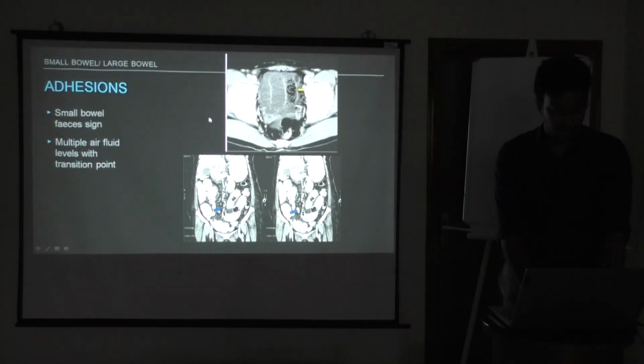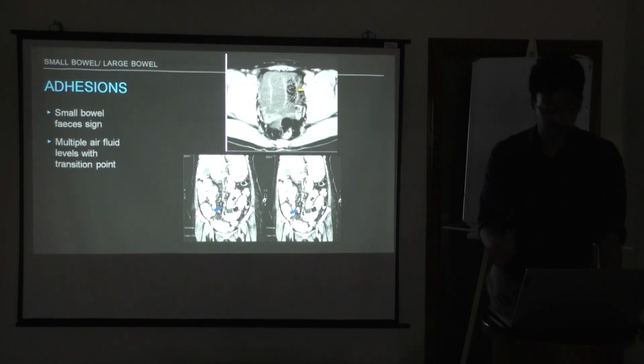So next comes adhesions. This is one of the most common causes of obstruction, but more often than not it's not an emergency. You can always wait for 24 to 36 hours as long as the patient is maintaining hemodynamically. So we have time for this. In this case you always ask for an oral contrast because it's not a surgical emergency. When you give the oral contrast, one typical sign to say that some obstruction is there is nothing but the feces sign.